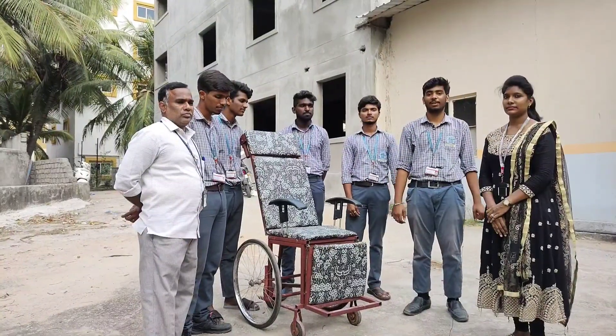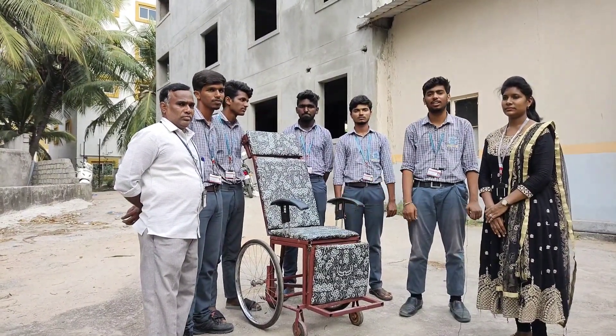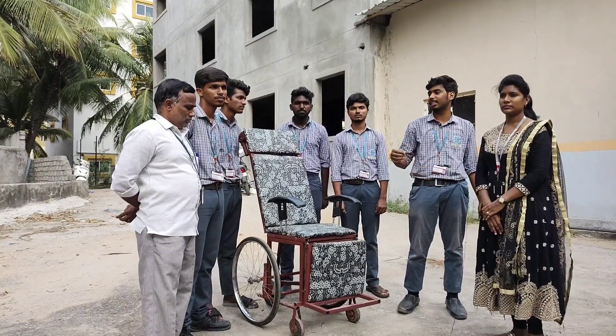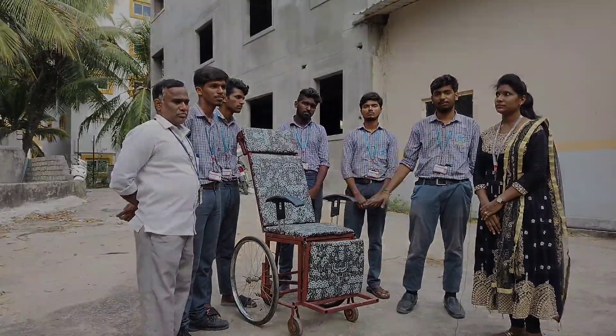Hello everyone, I am Amsovid. We are Diploma Mechanical final year students and we made this project — fabrication of a multi-purpose wheelchair — under the guidance of Shiba Ma'am and Lab In-Charge Charisher. This is our team and I would like to explain this project.